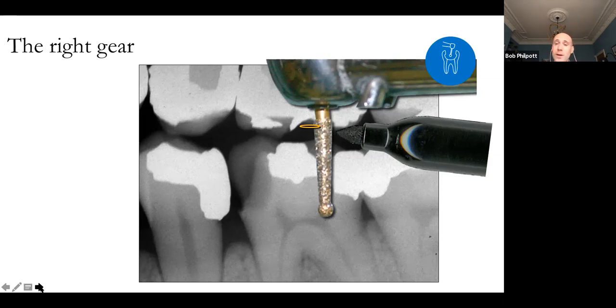And it's just crossed my mind in response to the previous question about, do I do a separate appointment for the core buildup? I spoke last week about doing multiple tooth isolation, and that does mean that sometimes it's much simpler to get the core out, locate some canals, especially in a tooth that, for example, has an irreversible pulpitis, where you don't have to instrument canals fully, but you want to get a patient out of pain. And it might mean that you could do your instrumentation, for example, in an upper molar, without rebuilding the tooth, quickly get in there, instrument, get a little bit of maybe Ledermix or Odontopaste or whatever your choice of medicament was, and then rebuild quickly at the end. So there are little cheats or little ways around it, as it were, also. But yeah, you do need the right gear to do an access.